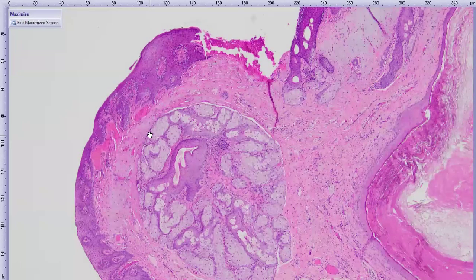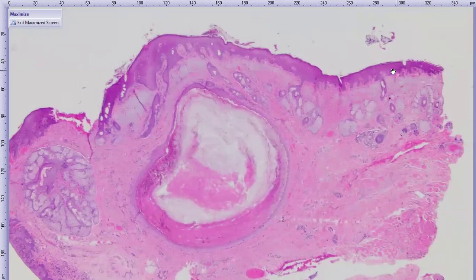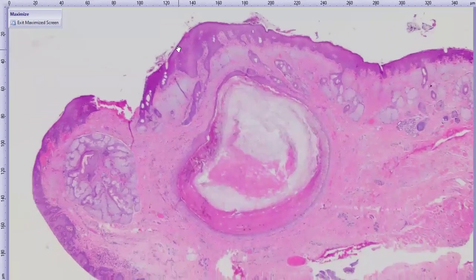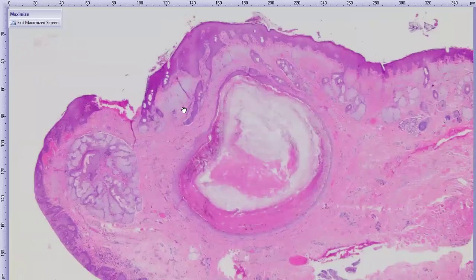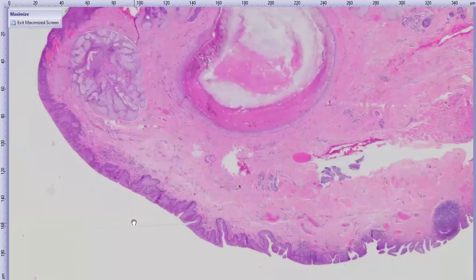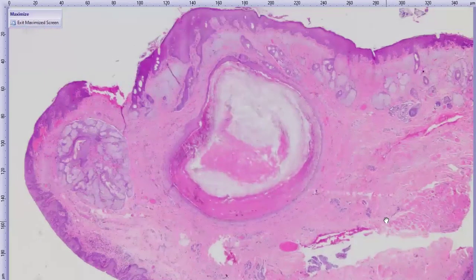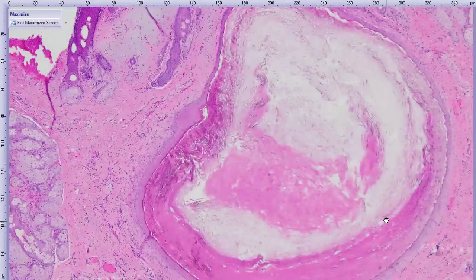The smaller mass that they took from the eyelid margin was kind of yellow looking. So we have haired skin here. Ooh, we're going to ignore that. And hopefully, if there's any problems, people online can let us know. So we have haired skin up here. We have our meibomian gland here, and our conjunctival epithelium is quite hyperplastic. Again, a little bit of lymphoid follicle formation here, and the mass effect is caused by this structure here, this cystic space that is lined.